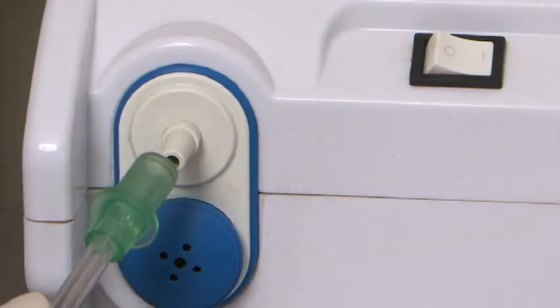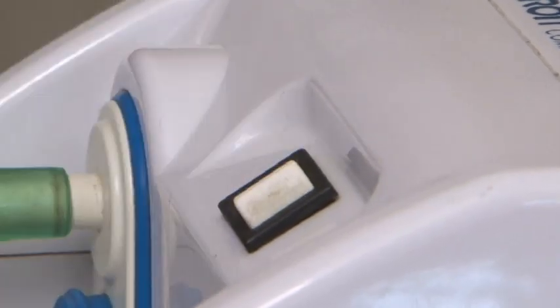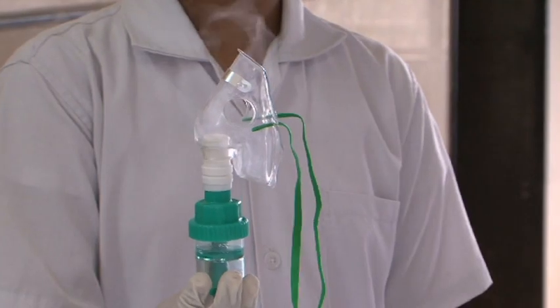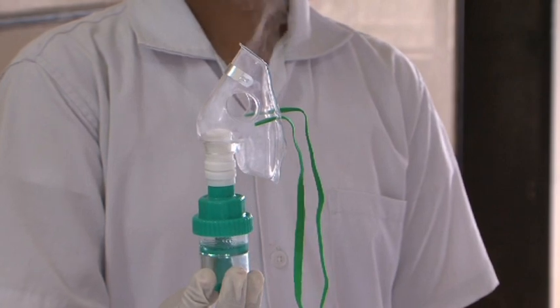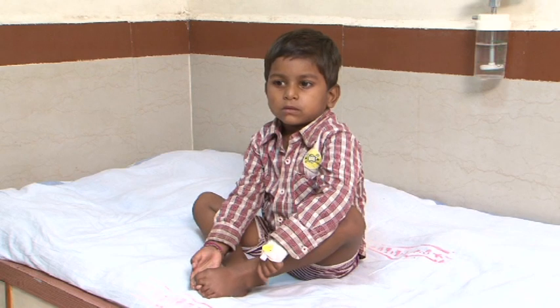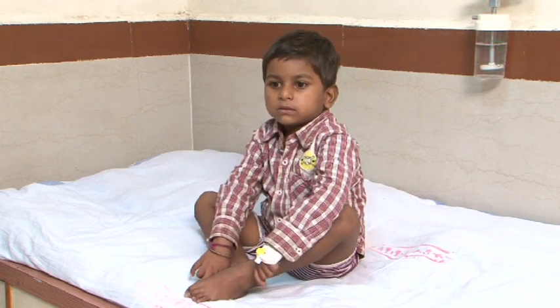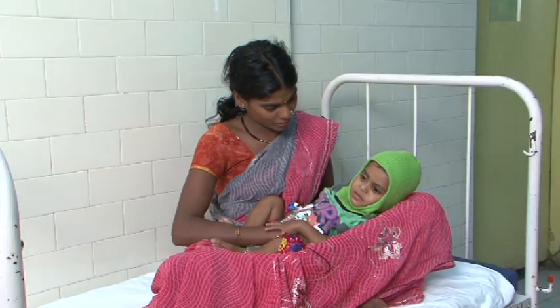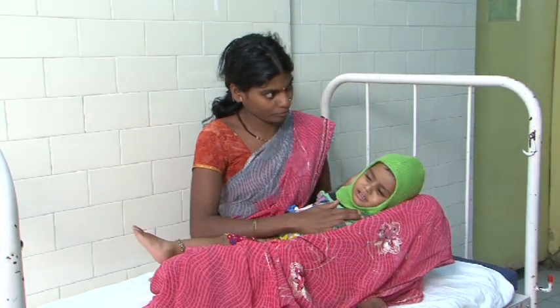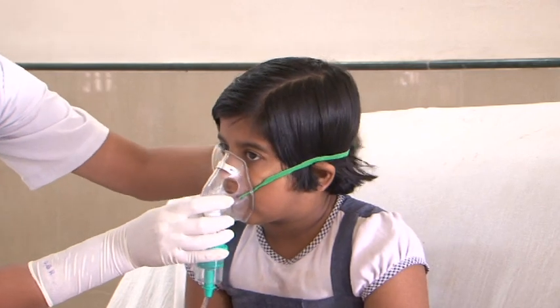Connect the nebulizer tubing to the port on the compressor. Turn the compressor on and check nebulizer for misting. Hold the nebulizer in upright position to avoid spillage. The infant or child should preferably be in the most comfortable position, or kept in upright position or semi-inclined in the mother's lap. If using a face mask, ensure that it is well-fitting.